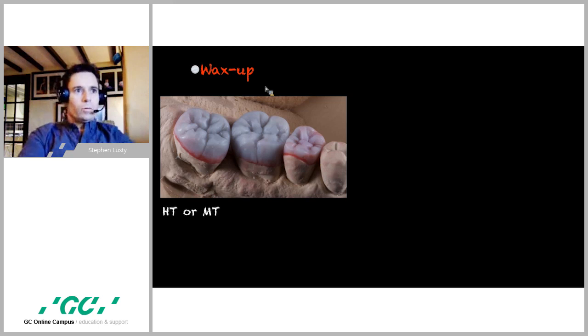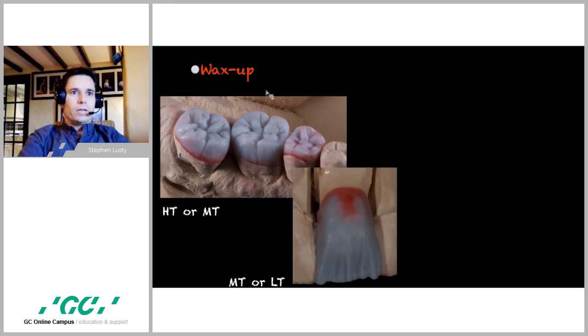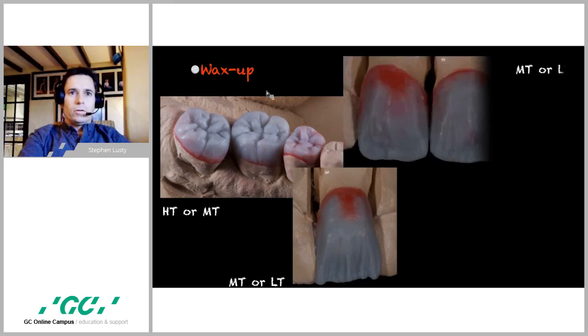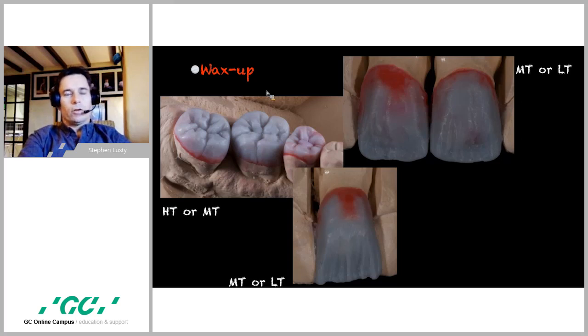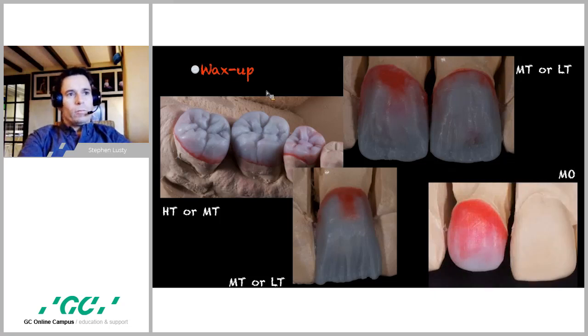So therefore, I would usually use these to full contour or for a very minor cutback. MT ingots can be used in the same way in the posterior region, but in the anterior region should always have some cutback, as the shade is close to dentine and the opacity is between dentine and enamel. So the LT ingots can be used to simulate dentine, and in my opinion, always layered, although at a real push, there could be stain and glaze in the posterior region if you're really trying to mask out something dark. And MO ingots are more of a block, have more of a blocking function and should be fully layered as you would a metal coping.